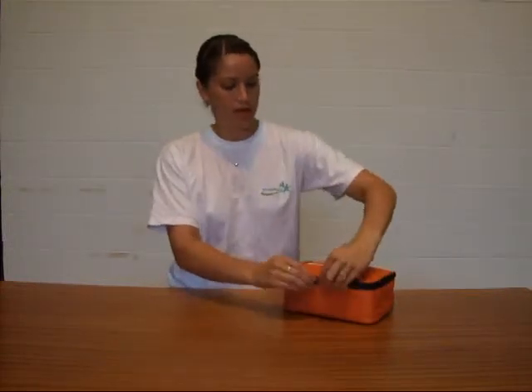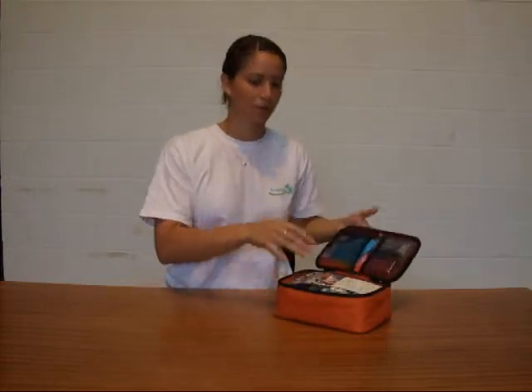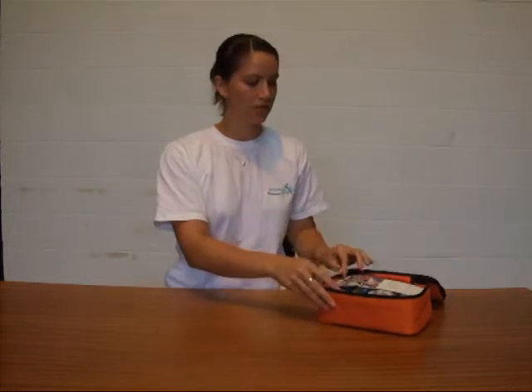Today we're going through some of our first aid kits. This one is our basic first aid kit, designed in conjunction with Loughborough University's medical department. We have a double zip, really easy to open, and our bright orange bag that's easy to grab on the side of the pitch, and all our contents in here.